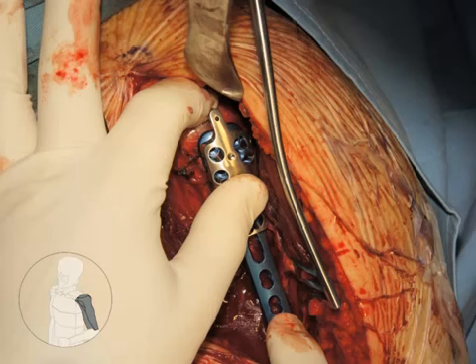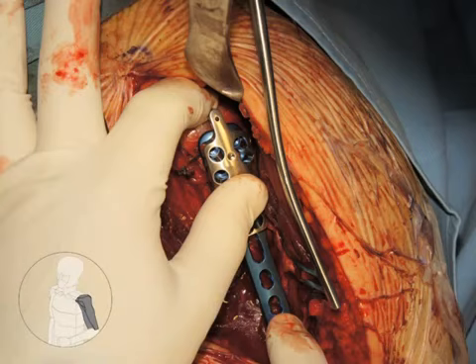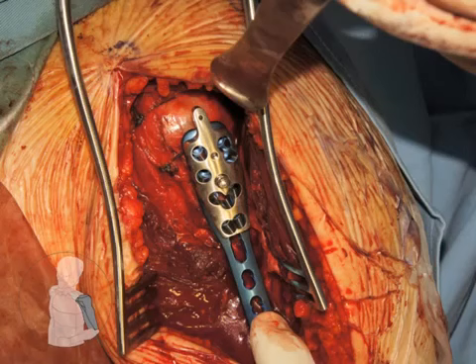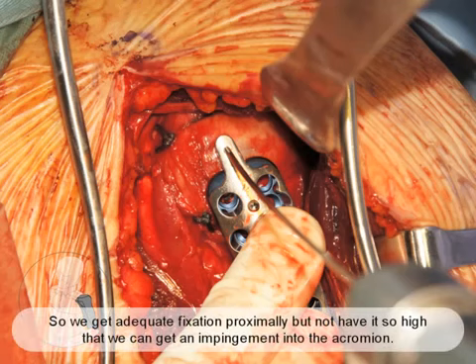Plate is chosen. We know that these plates are designed to be positioned just posterior to the biceps tendon, and you want to make sure that position is at an appropriate level superiorly and inferiorly. These plates were designed so that when you have the external jig on it, there's a small hole in the top. Using a K-wire through that hole, position the plate in the right place so we get adequate fixation proximally, but not have it so high that we're going to get impingement into the acromion.